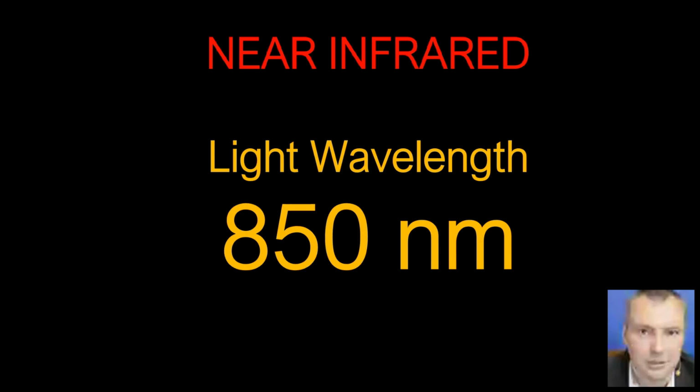Also, all the time, I will be referring to the DiagnoCam as the laser device, because it is actually a diode laser device, a very weak diode laser device, in the same way as a laser pointer is a diode laser device. Because of some, let's say, marketing reasons, laser is a very magic word in our dental office, and it always sounds right. So remember the wavelength when you get a professor of physics in your dental chair.